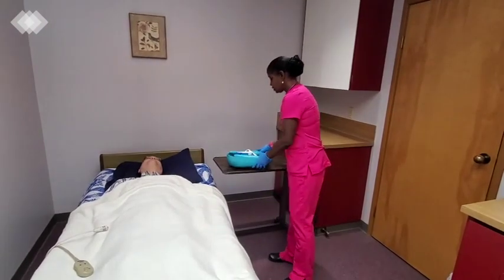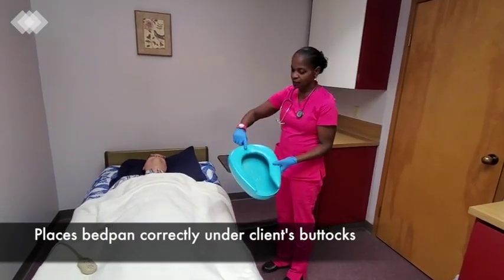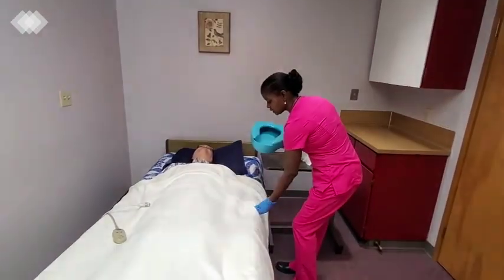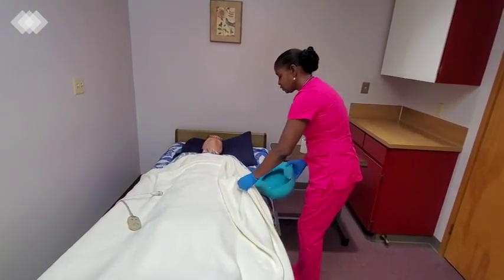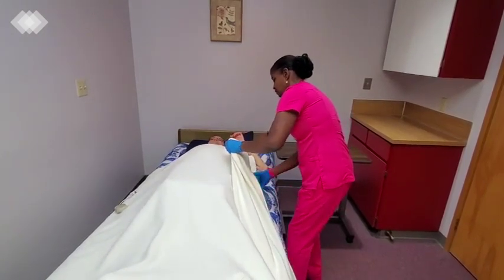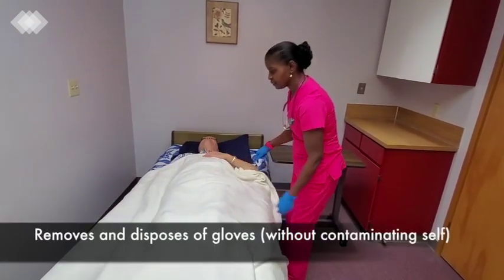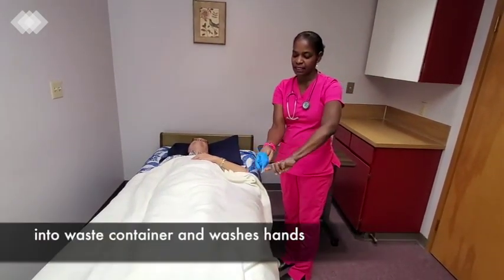I'll get the bedpan. I'll put the widest part of the bedpan against his back, exposing only the area that I need. Can you lift yourself up, Peter, so that I can put in the bedpan? And making sure the bedpan is in the right position.